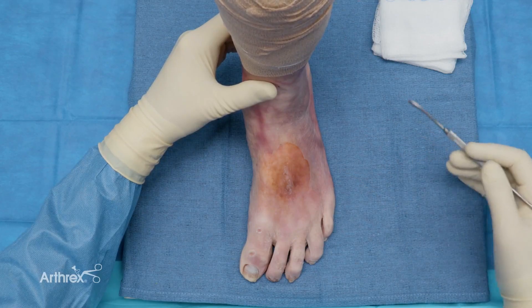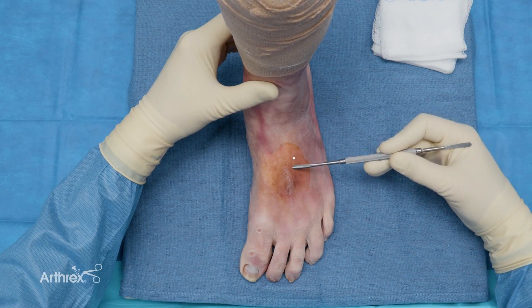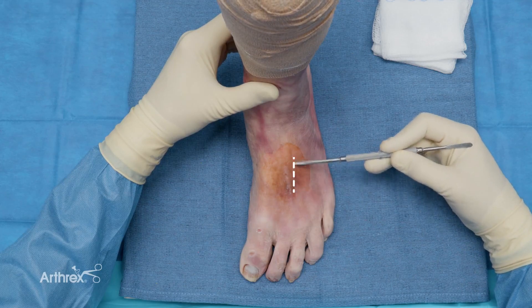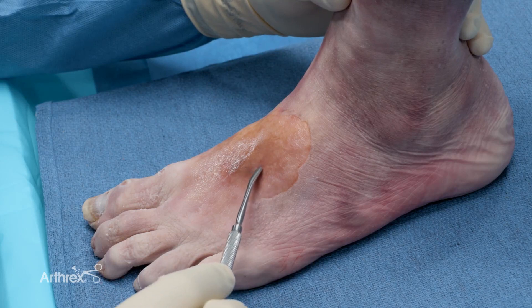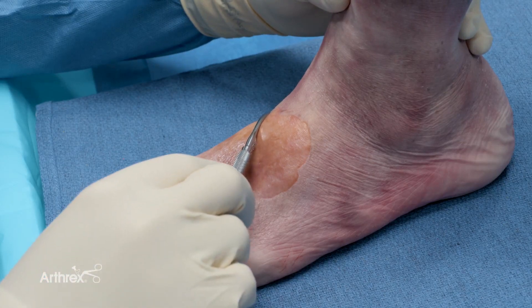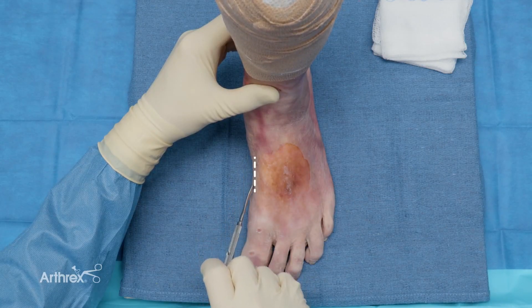First, the incision on the dorsum of the foot. It's best to place this incision on the lateral aspect of the second metatarsal base, approximately here. That'll allow you adequate angle without having to retract the soft tissues to then place the K-wire across towards the medial cuneiform. The other incision will be medial, approximately here.